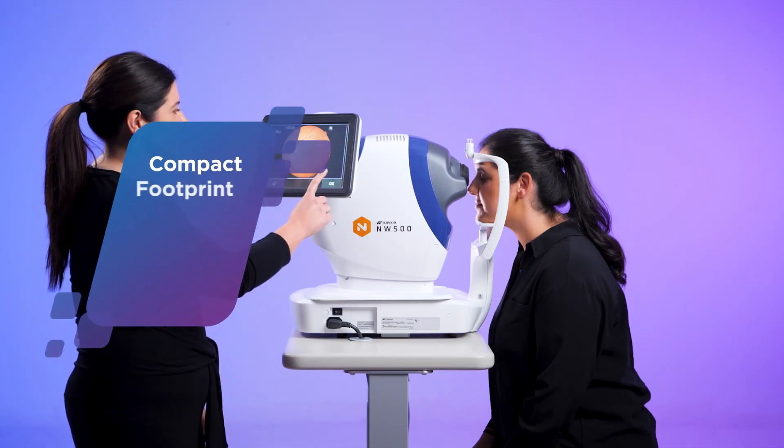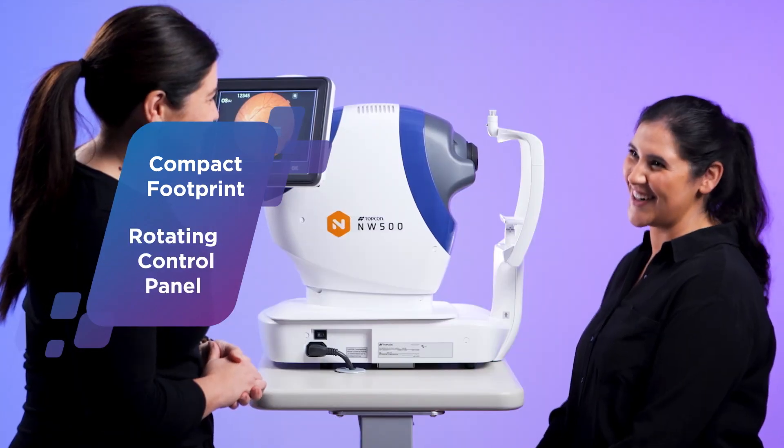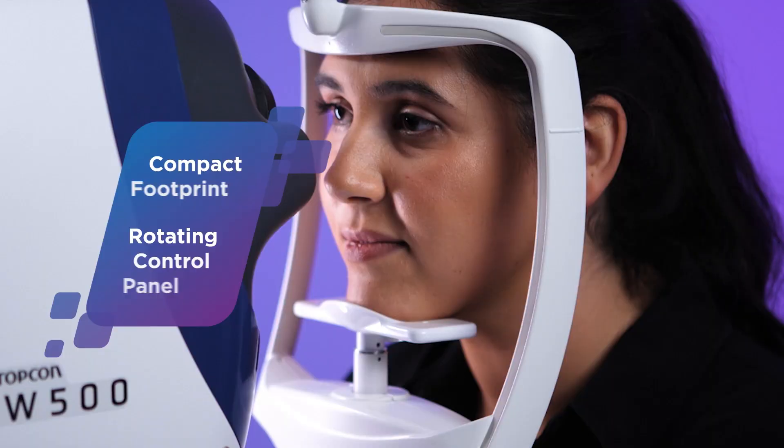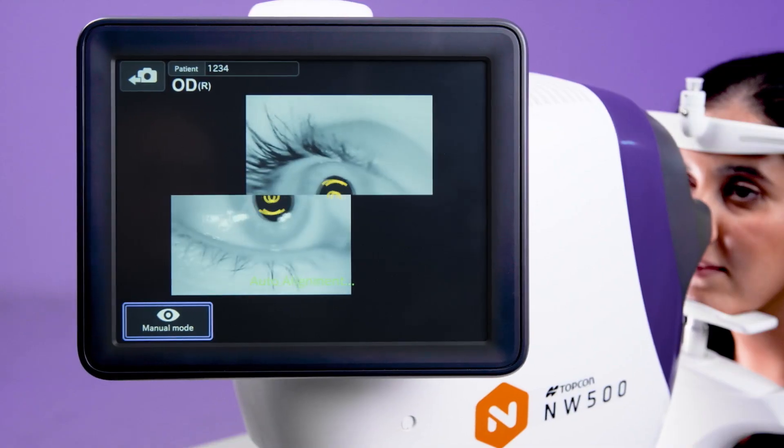The NW500 features a compact footprint and rotating control panel, so the device can be operated from virtually any position, making it ideal for small spaces.